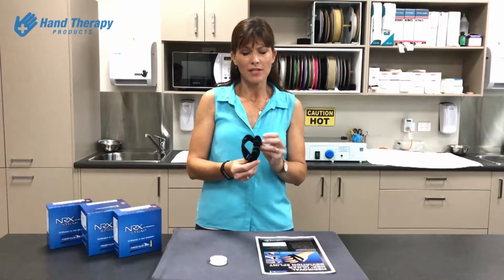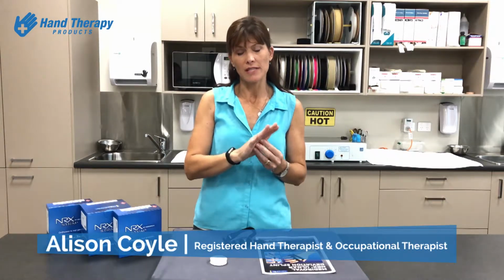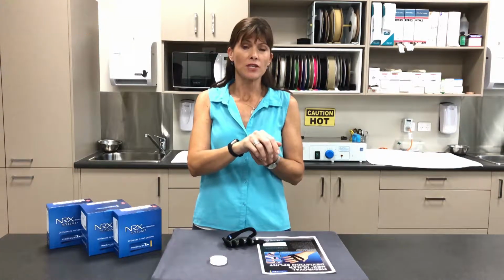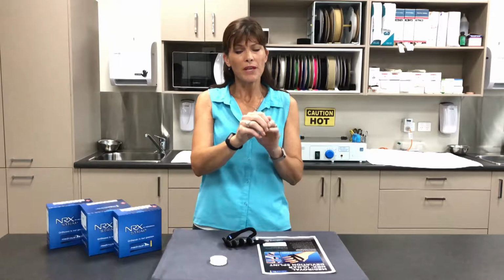In this segment I'm going to demonstrate the Mediroyal NRX Ulnar Deviation Splint. Now, ulnar deviation of the MCP joints is common in clients with rheumatoid arthritis or other inflammatory conditions. During periods of inflammation, what happens is the supporting structures around the joint become overstretched. So as a result, pinch and grip forces gradually push the joints ulnarward.